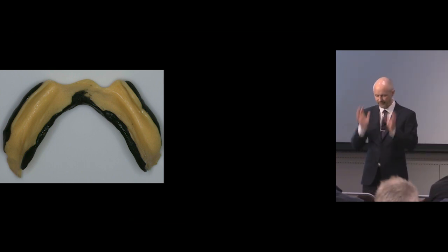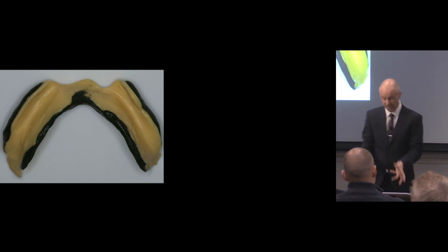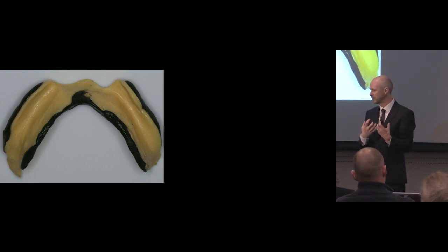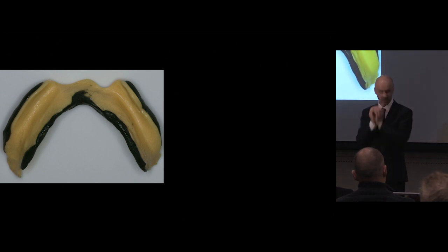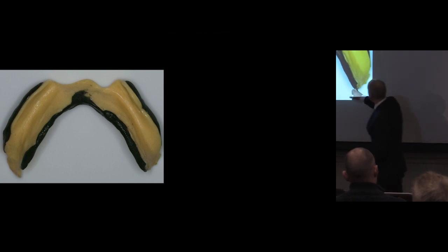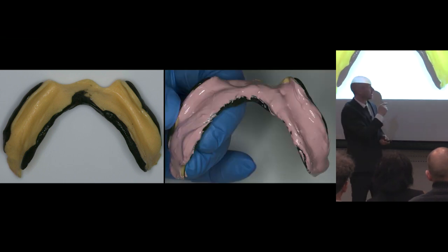If you imagine a normal special tray with a big block of acrylic that sits over those front teeth and then extends back, that big block at the front pushes the lip away and prevents me from doing these movements of the E and the U and actually moulding the shape properly. So I can do it without the tray sitting over the front teeth getting in the way. I put the Greenstick on, just a really thin earthworm size on the inside, and then a thicker earthworm on the outside. It goes into the mouth and I get the patient to perform 5 movements, which I will demonstrate on the next thing.